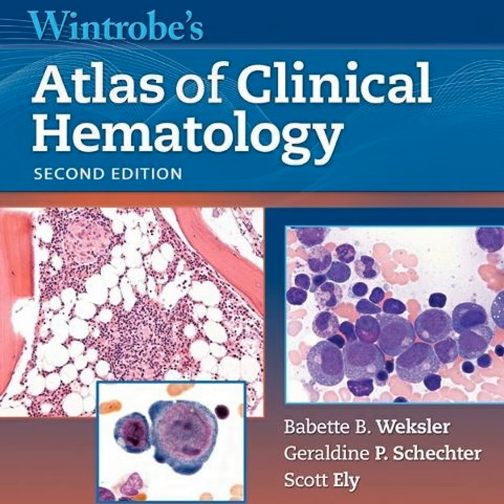It's not one thing. Not at all. Morphology gives you the foundational visual evidence, the dysplasia, the fragments, the architecture, and then the molecular and flow techniques give you the precise classification and prognostic data. Morphology is still the essential framework. It tells you where to aim those advanced tools. Absolutely. If you miss the hypersegmented neutrophil on the smear, you might miss the diagnosis entirely, no matter how good your lab's B12 assay is. Which brings us perfectly to our final thought, a synthesis exercise that pulls all of this together.